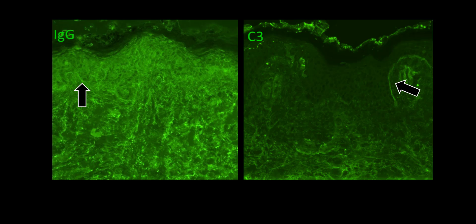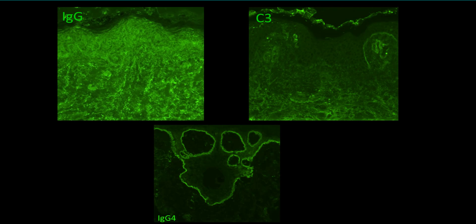Here's an example from the series in which there was very focal linear IgG deposition along the basement membrane zone. Due to considerable background staining, it would be very difficult to call this finding. C3 also shows some focal and discontinuous linear deposition, which would not alone be diagnostic for subepidermal autoimmune blistering disease. In the same case, IgG4 demonstrated strong continuous linear deposition along the basement membrane zone, which increased confidence in the interpretation of IgG and C3 changes.